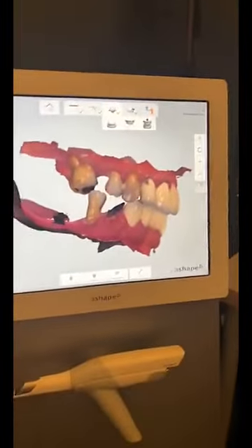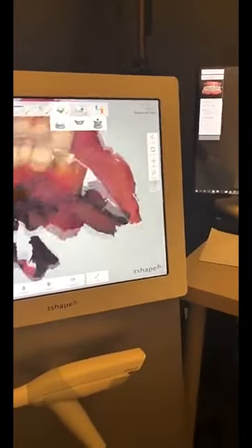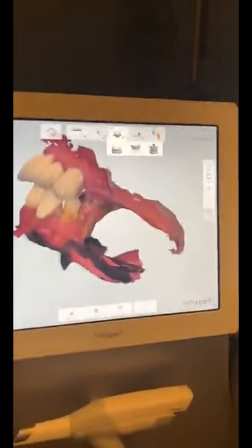From this, we can understand that digital dentistry is composed of different levels of sources of information inputted all together and processed with a specific type of outcome that can be either printed or milled. It's very complicated, but I'll give you an example of what I use in my daily practice. As you can see, this is a first source of information, an STL file or a 3D digital impression through what we call an intraoral scanner.